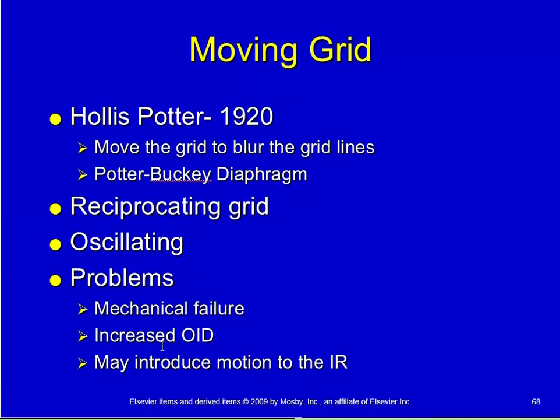Two is it increases the OID. Using the grid directly under the tabletop but above the bucky causes you to have to increase your OID. You don't do that; it's in the design of the table. There has to be room for the grid, and room for the grid to move as well. So there's a space there that naturally increases the OID.